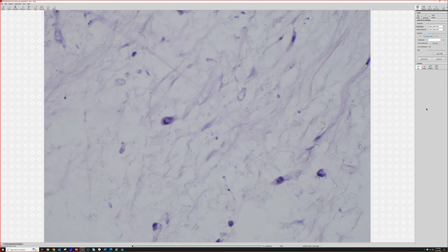So any takers? Any other ideas? Myxoma. Yeah, myxoma. Good. So this is a myxoma. And if you have one in the muscle, we call it intramuscular myxoma. That's kind of outside of the realm of dermpath. And in the skin, we can call it a cutaneous myxoma or a superficial angiomyxoma is another name. Because the ones that are superficial tend to have more vessels to them.